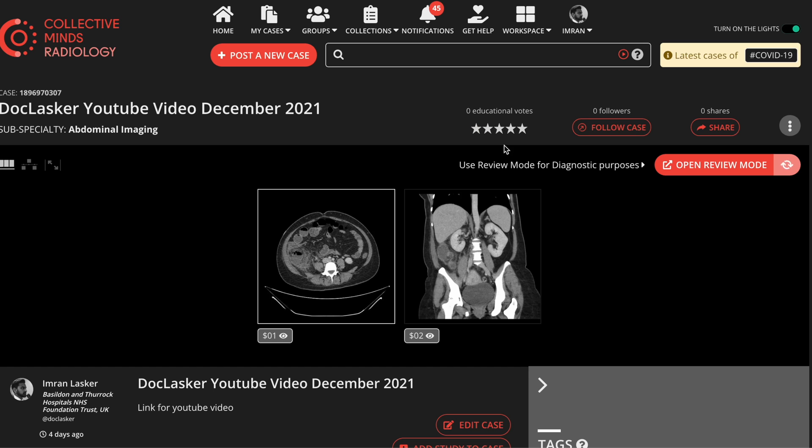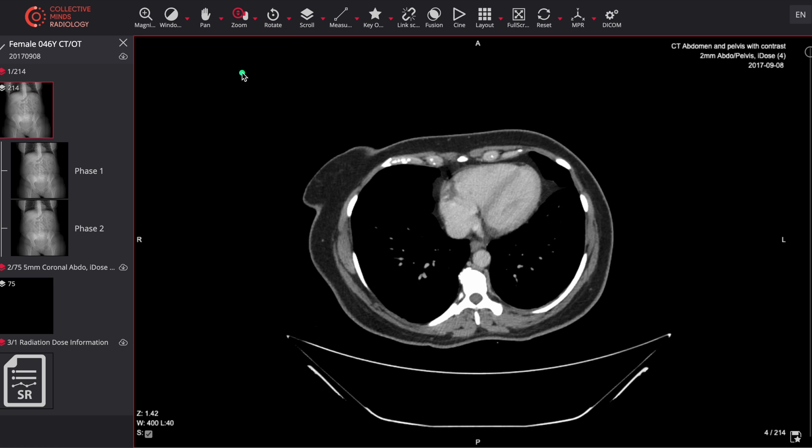We're going to have a link down below for you to be able to go through the case. You can do that prior to watching the explanation video which is going to come up. Once you're on the platform, what you should see is this particular screen. Go straight through to the review mode button over here and that will take you through to the scan. Once you're at the scan, it may be useful to use the cloud button which will enable you to have slightly smoother scrolling through when you're going through the images yourself.